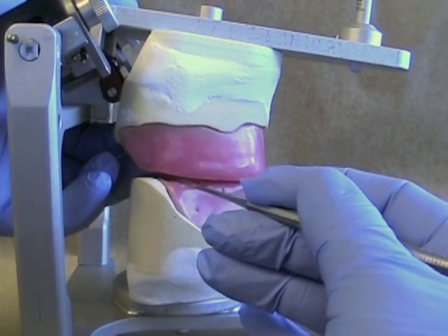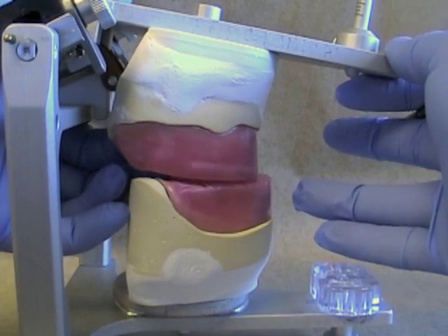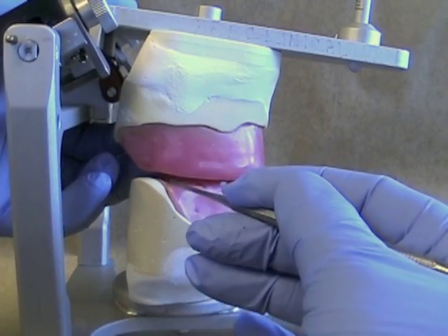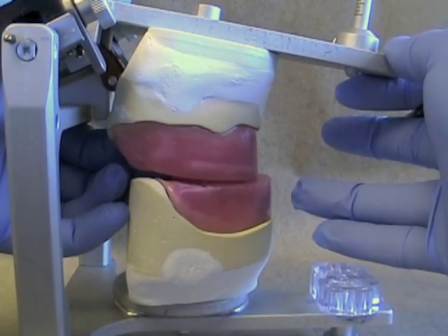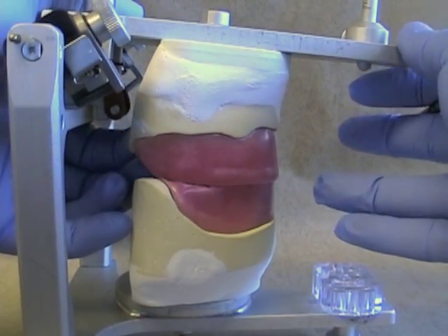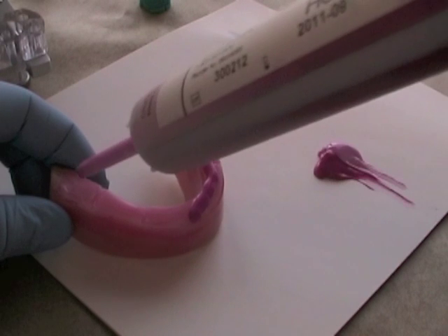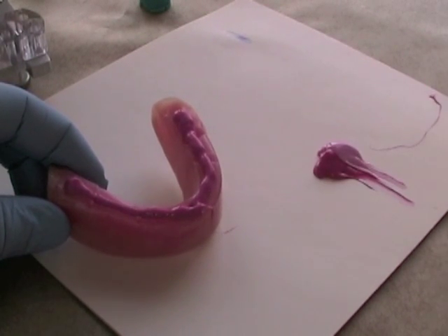When we make a protrusive record, what we are doing with our bite registration material is registering the amount of separation at the back ends of the record bases. There will be only one condylar inclination that will register that amount of separation. In order to record the gap properly and make it as easy as possible to set the condylar inclination, make sure you cover the entire surface of the occlusal rim.